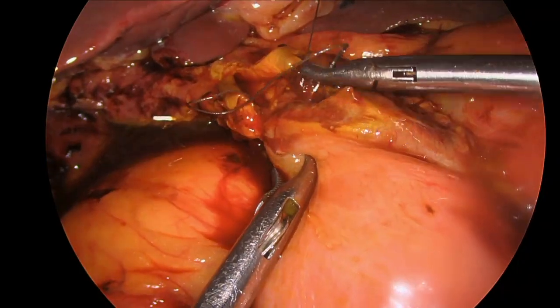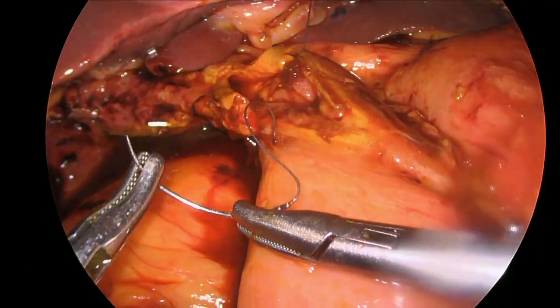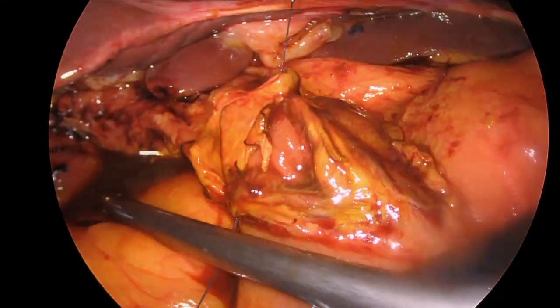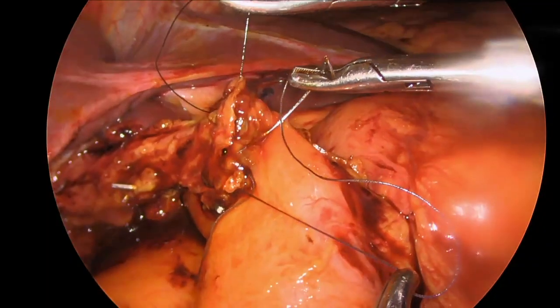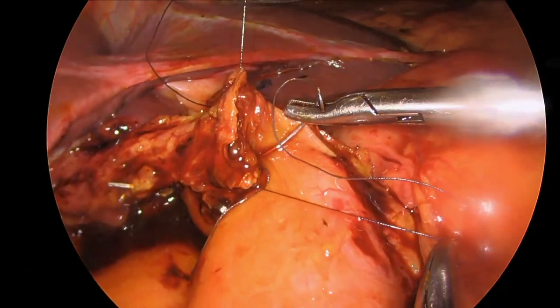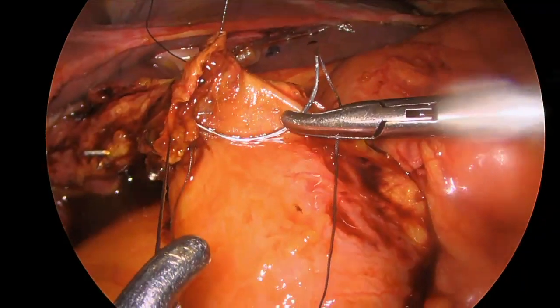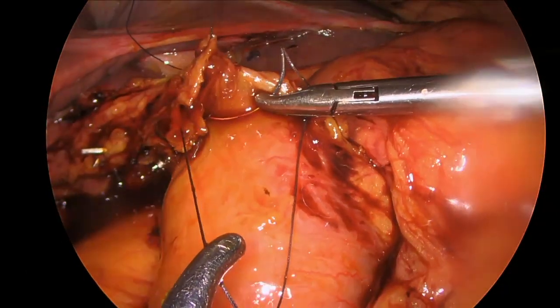Once the back wall of the anastomosis has been completed, we keep tension on the suture and prepare to do the front wall. Here you can see how wide open the anastomosis is. Another suture is used to run the front wall of the anastomosis closed, again in a duct-to-mucosa fashion, taking careful bites and being careful not to occlude the lumen.